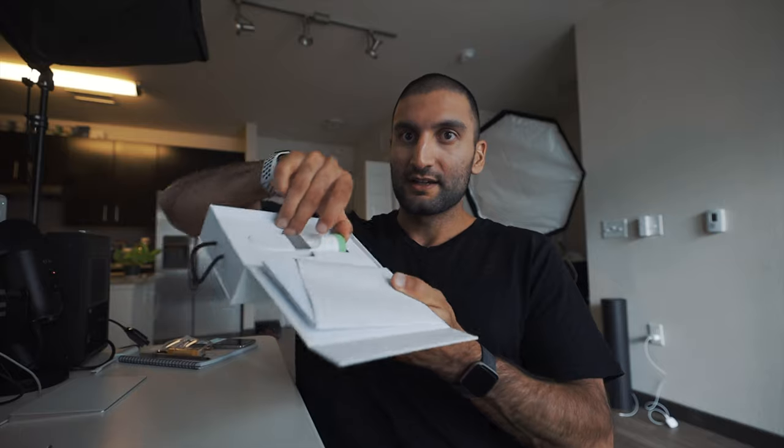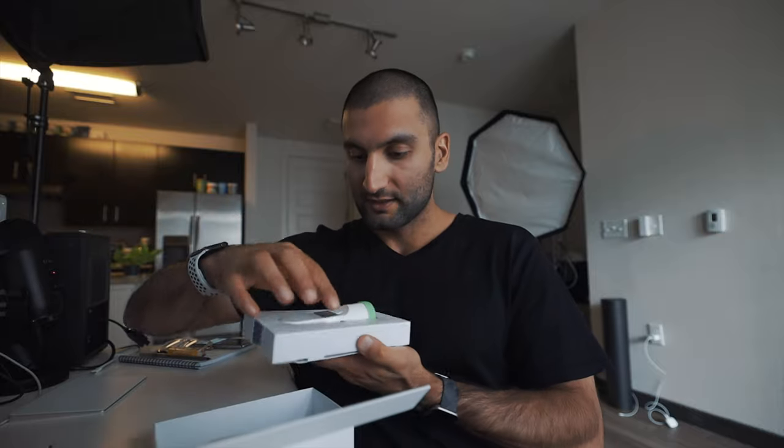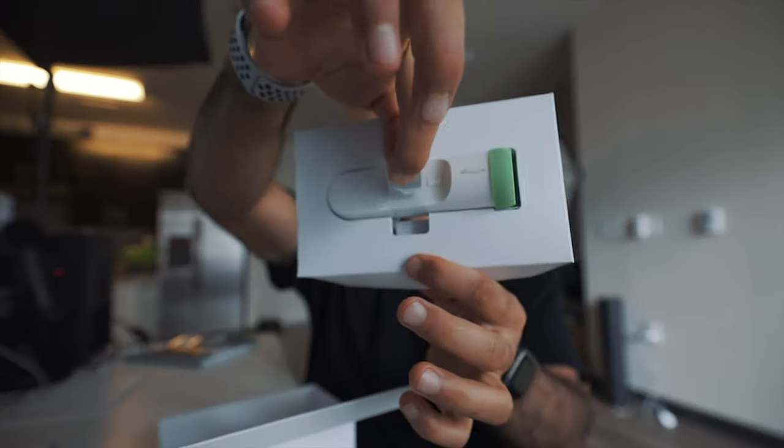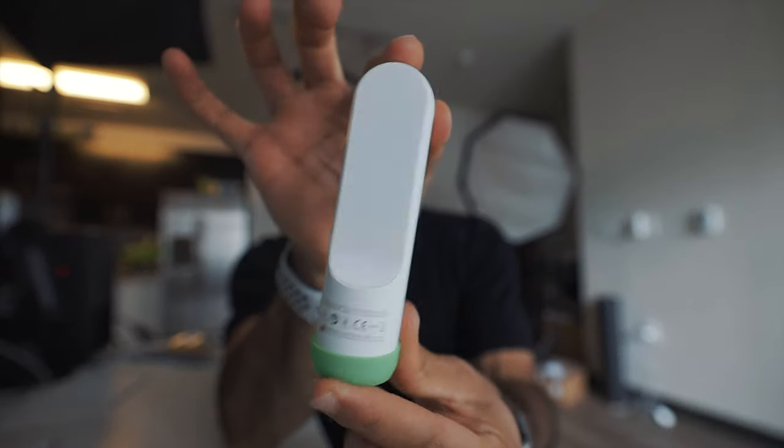There it is — the Withings Thermo smart thermostat. You can pop it out of the box. It comes with a box, I guess. I need to open this seal. And just break it. There you go. The thermo is still alive. Might have scratches — but this is the actual device itself.